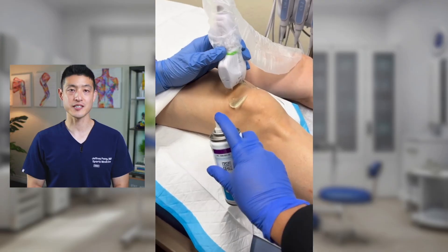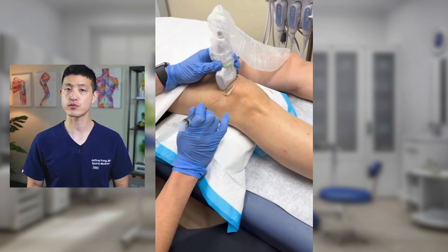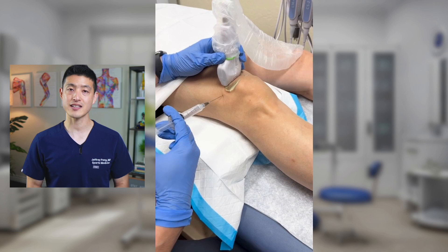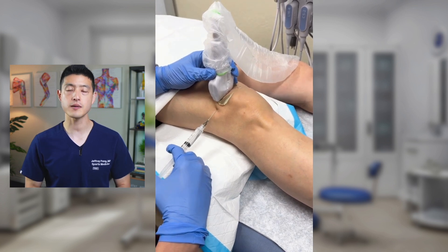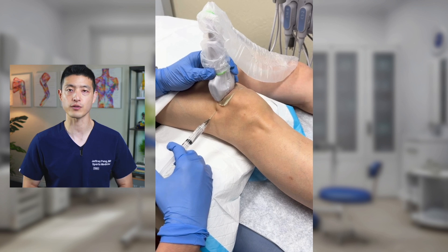So what you're seeing here is my assistant spraying ethyl chloride, which is a topical anesthetic used to numb the skin before injections. This cools the skin and decreases pain at the injection site. Next, I'm using a 22-gauge needle to administer a small amount of ropivacaine under the skin. This is another type of local anesthetic.